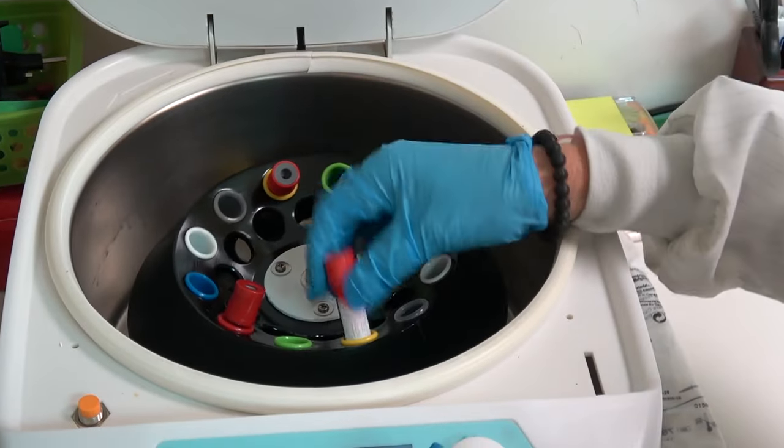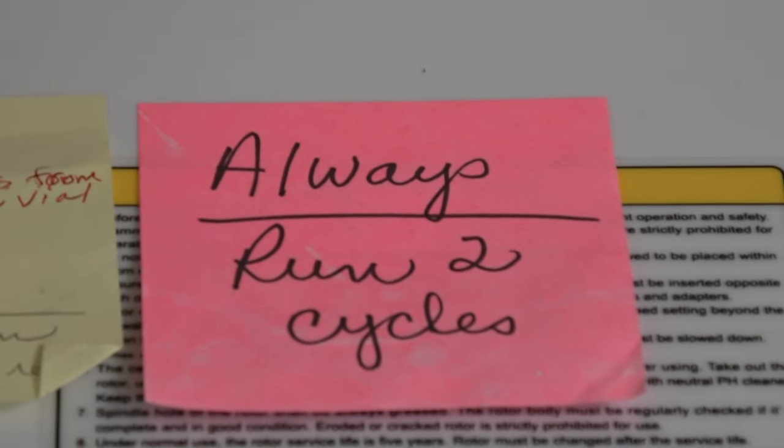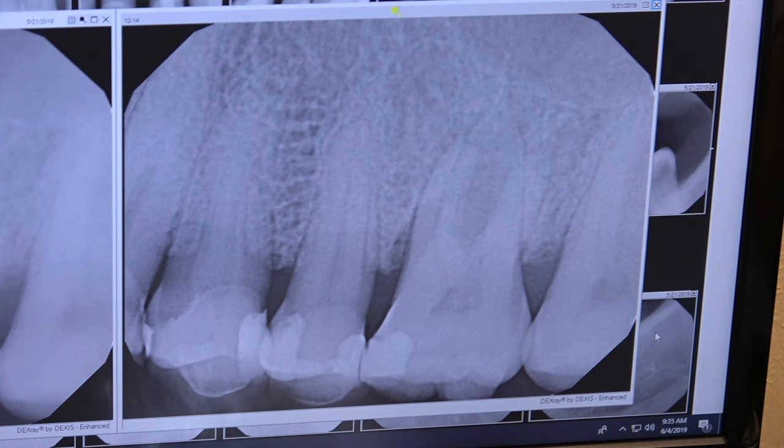Then you put these in a centrifuge. You can refer to the link in Dentistry Master Classes. And I want to do that before I extract the tooth.